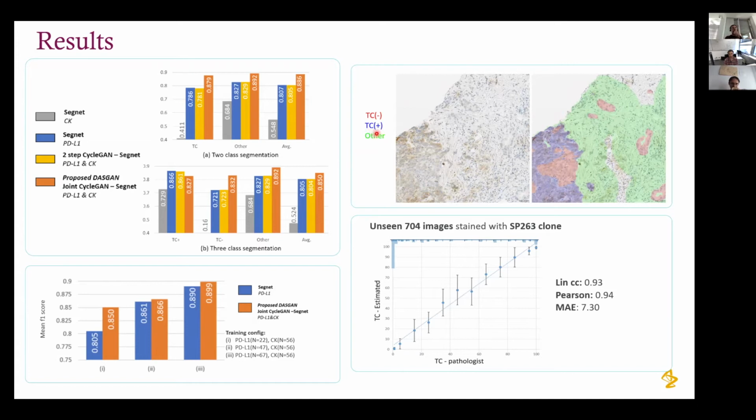Basically the sum of tumor cell positive by tumor cell positive plus negative. And what we did here was also validation of this score against pathologist scoring. So we had 700 slides where a pathologist scored these slides for PDL1, and we correlated that. On the x-axis, for example, you see the scoring from the pathologist from 0 to 100, and on the y-axis, we have the estimated one from the machine. And we see there is a very nice correlation across the whole range, where we have a concordance of 0.93. So it's really, really nicely concordant.